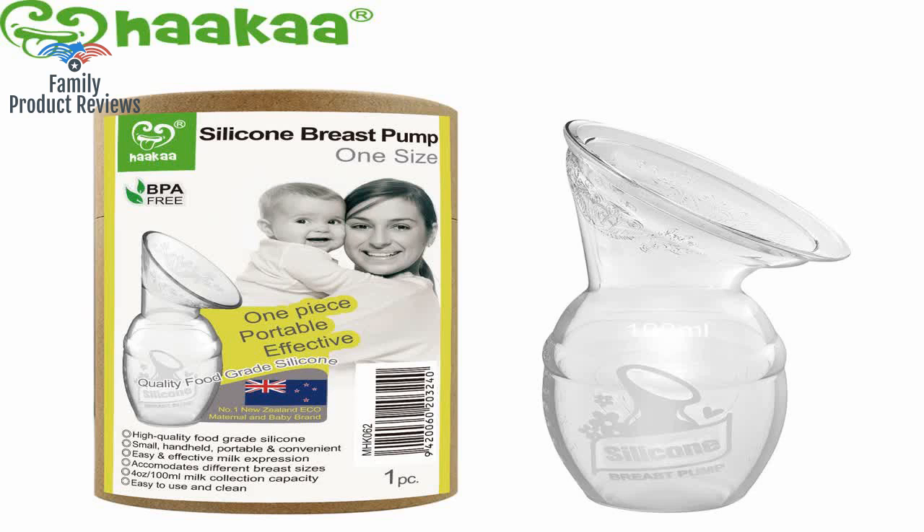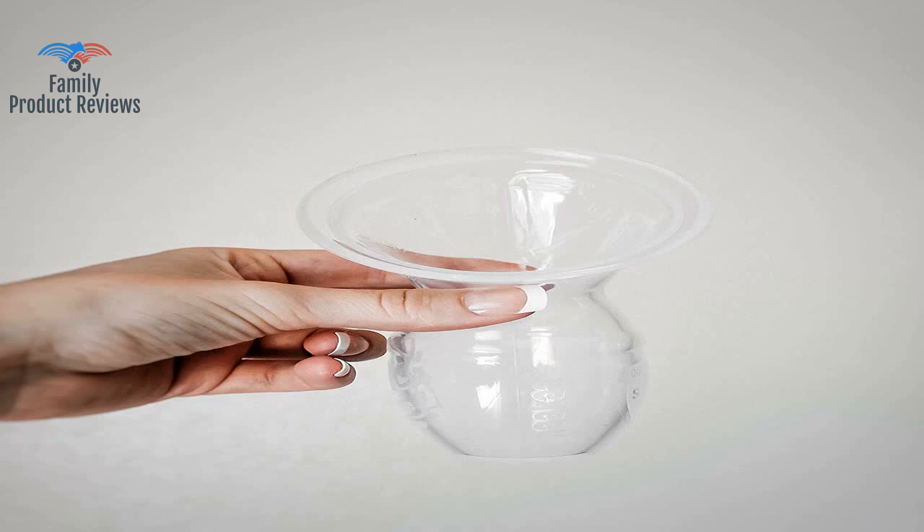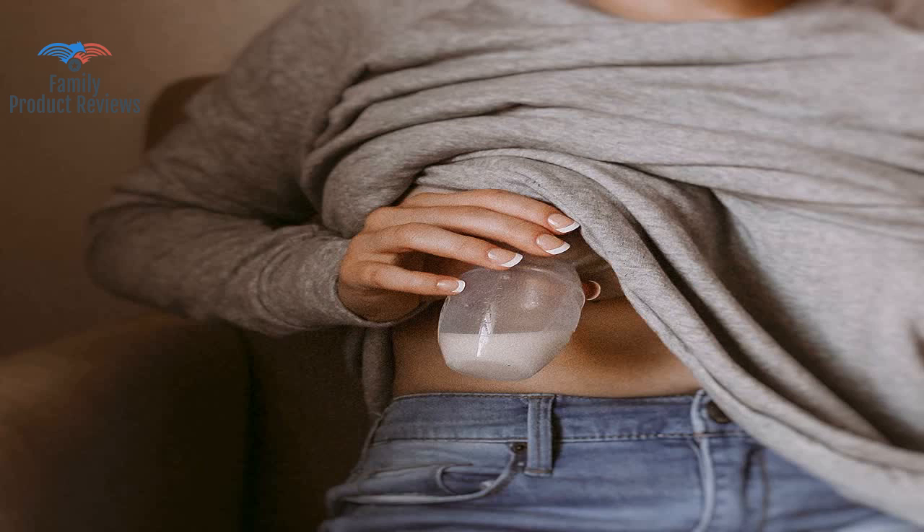Overall, for a cheap product it collects milk very easily. Make sure to watch a video on how to correctly put it on — the way you have to bend the flanges back, stick your nipple in, then fold the flange forward.